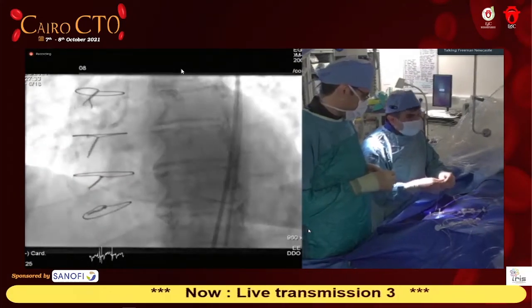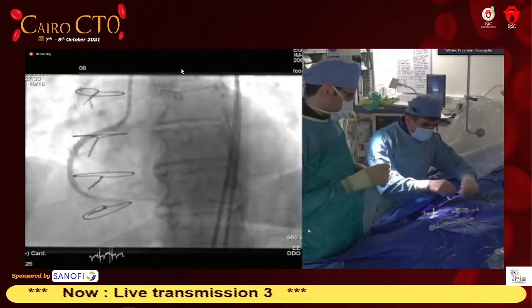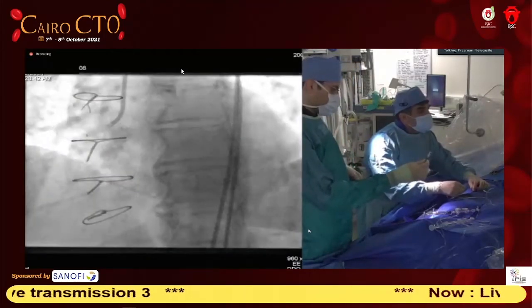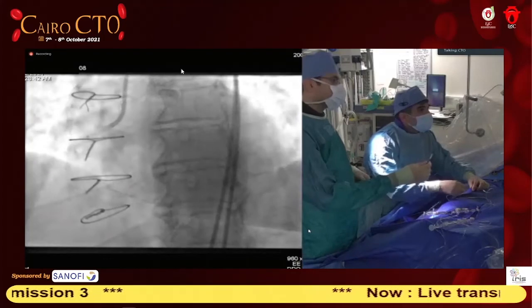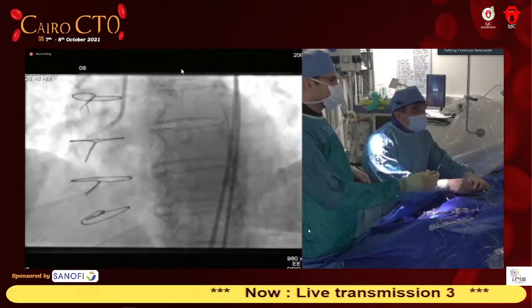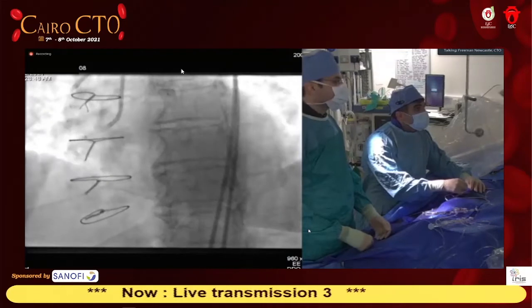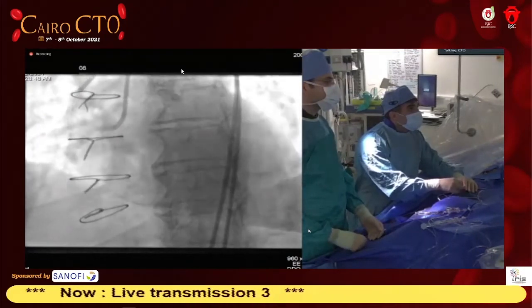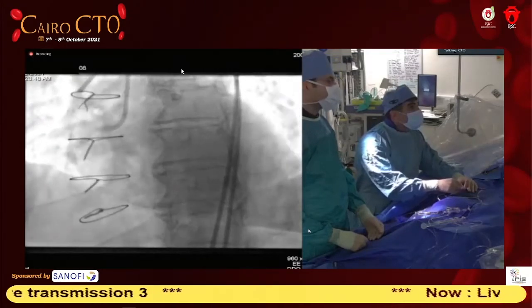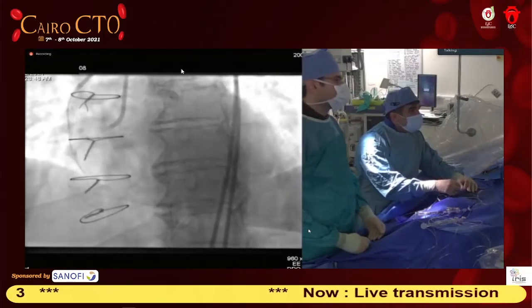Now there are some more coils on the market right now that you could use through the microcatheters such as Corsair or Fine Cross, the neuro coils. You need bigger coils, yeah? Yeah, and here we're going to use hairy, bigger coils. I'm not too worried about it. Fix that for me so it doesn't advance. And the question also becomes, where do you put the coil? Boston or EV3? Sorry? What type of coil do you use now? I'll show you. What I usually use is the Vortex coil. Okay. And these are from Boston.